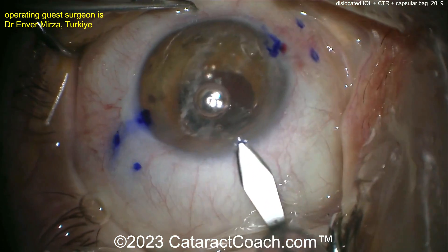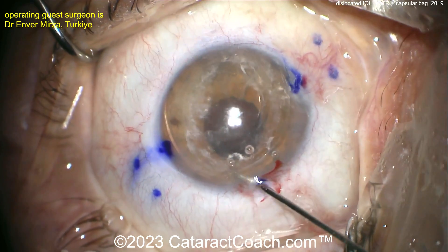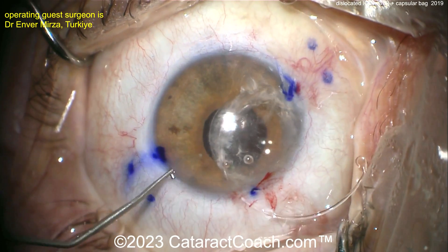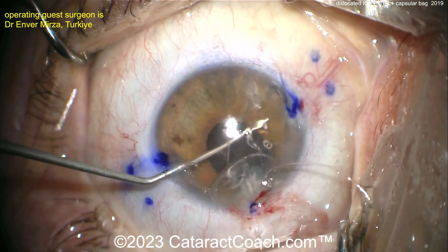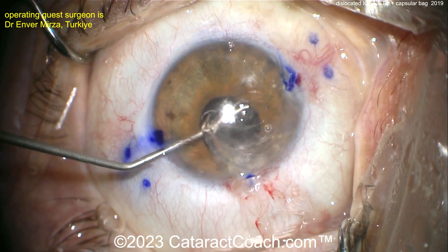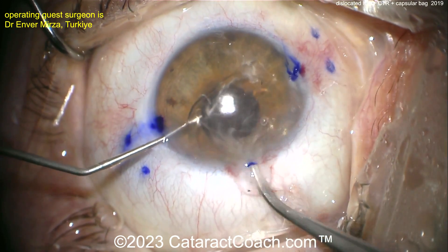Interesting — enlarging the incision to maybe 3-ish millimeters. Now pulling out the CTR — there you go. Grabbing it and taking it out of the eye — and it's out. There's the lens; we can do our twist-and-out technique. The CTR is out, and now you just have a remnant of the bag remaining in the eye along with the IOL.